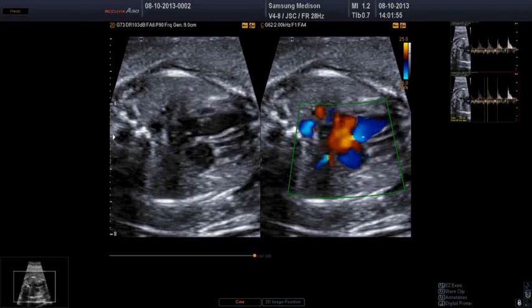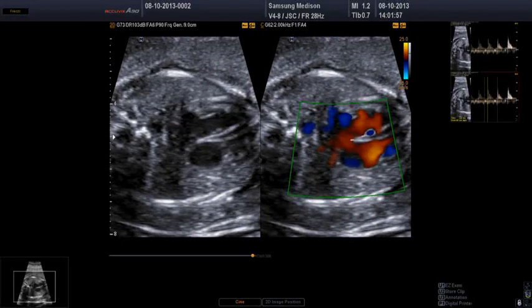And you can see here the left atrium with the flap valve, and you can see the pulmonary veins coming on the 2D, and the corresponding Doppler signal coming from the left lung, showing you a pulmonary vein, and a pulmonary vein coming here from the right lung. There's another one there. And you can see that this is coming indeed to the left side of the atrium, because on the corresponding image you have your atrial septum.